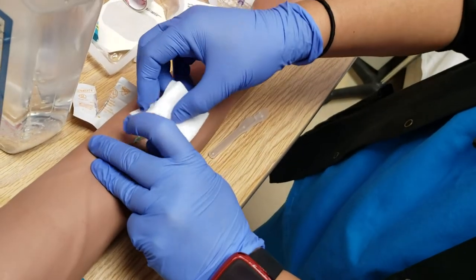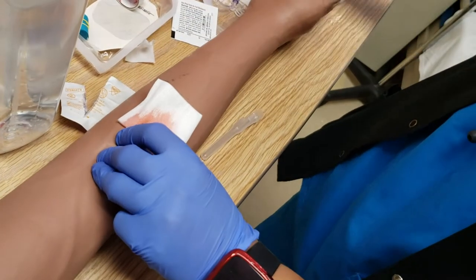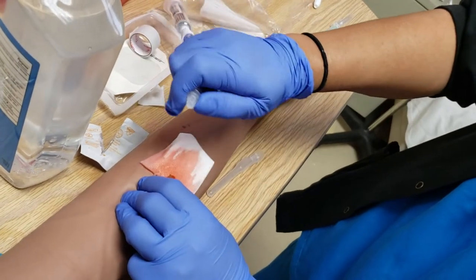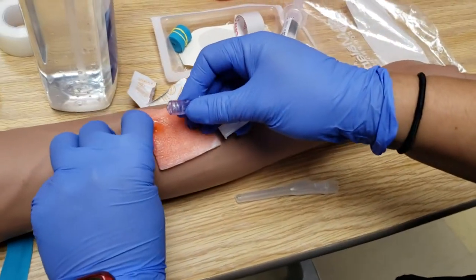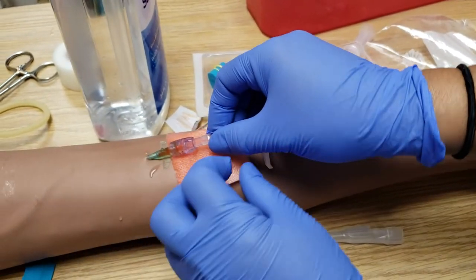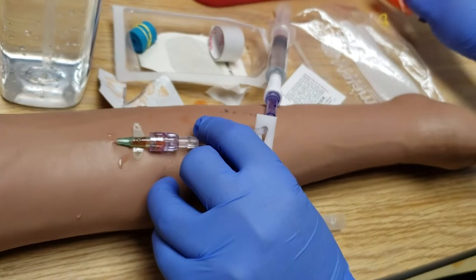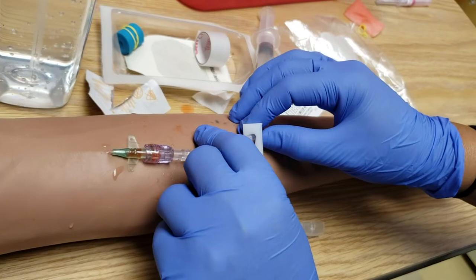This one is leaking a lot — usually it doesn't do that. It looks like an artery. I'm going to take that off. I didn't touch that; I'm using this to keep that stable. This patient must be on a blood thinner. Get rid of that in the trash. If I had a little bit more gauze I'd clean that up a bit.